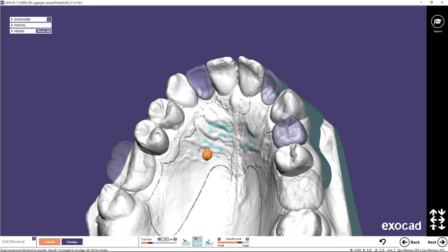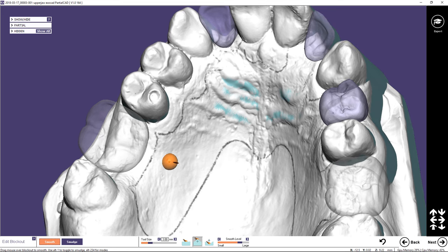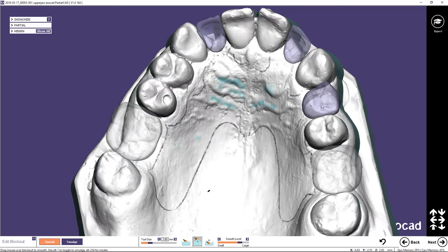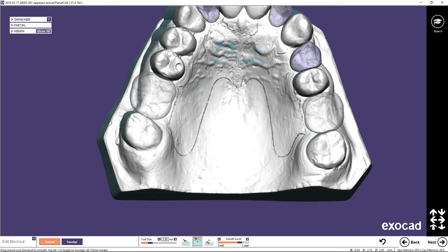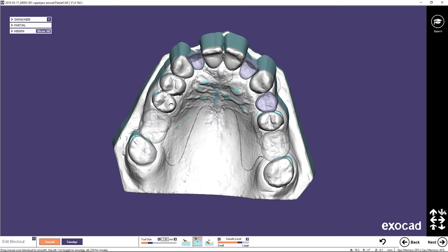Model imperfections or holes can be filled here as well. Click Next.